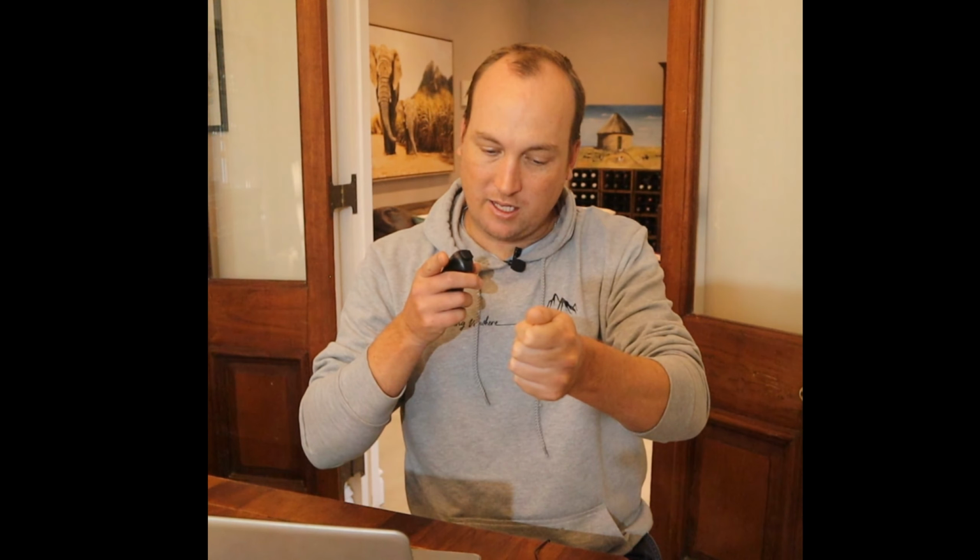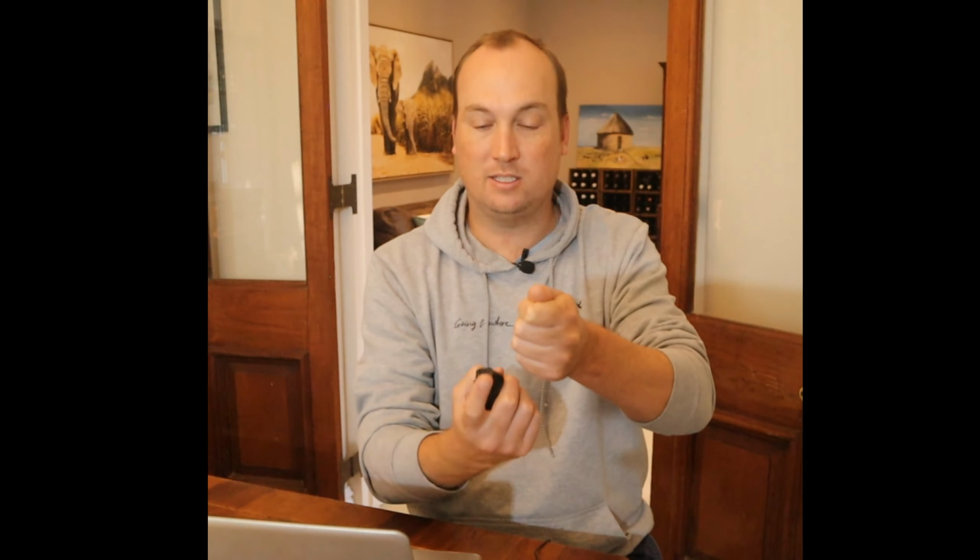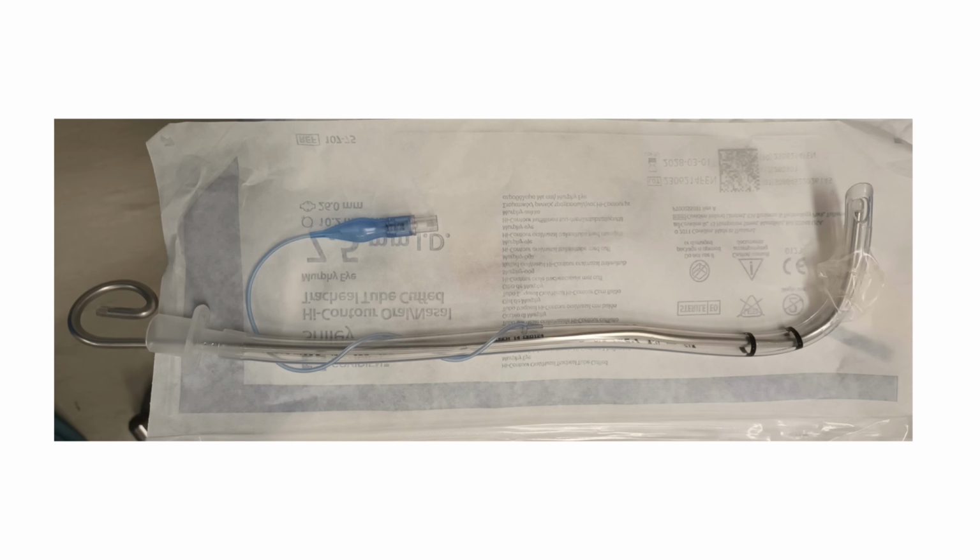But it still can be extremely difficult to intubate these patients. You get a great view of the larynx, but to actually get the endotracheal tube now to advance anteriorly and go through the larynx is what's difficult. And you may need to put a curved stylet in the endotracheal tube, or you might need to use a gum elastic bougie to get the endotracheal tube in the right place.